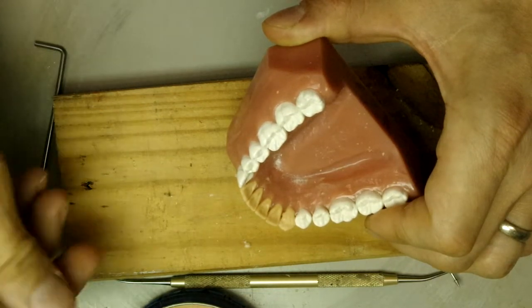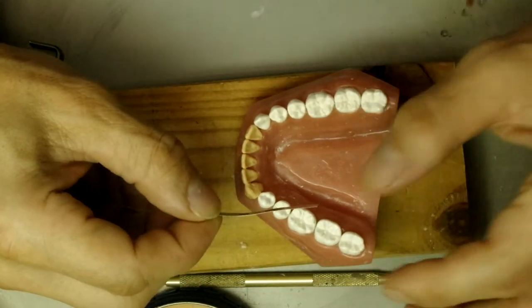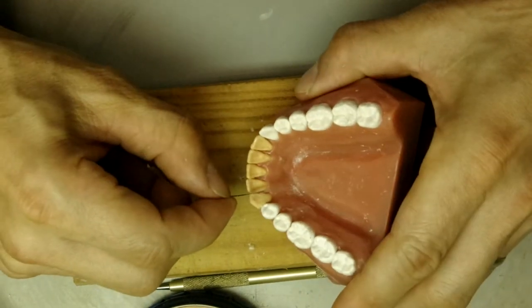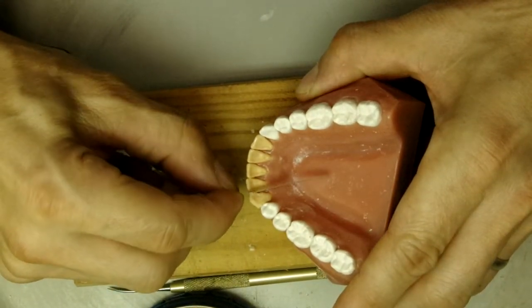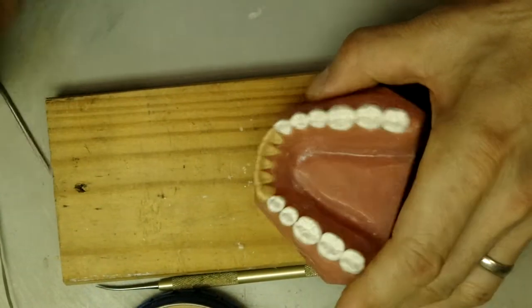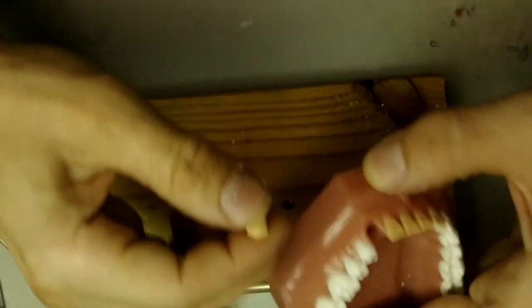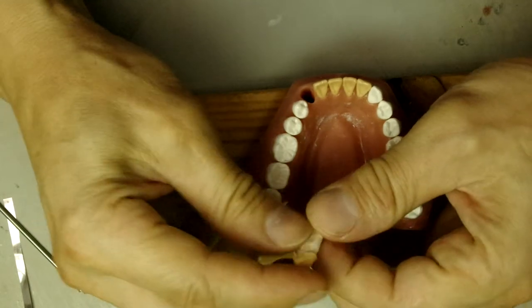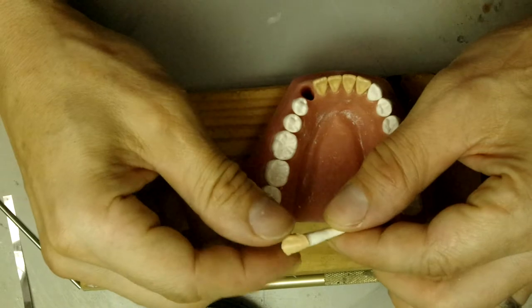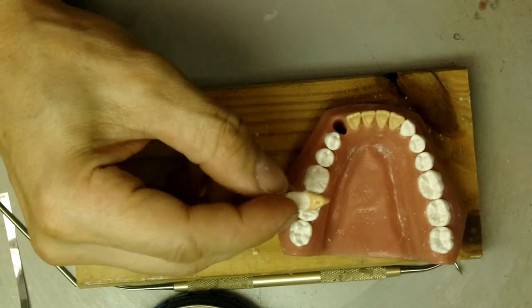Now we can take a little saw, and we're going to saw the interproximal so that we can remove the canine, just like that. I'm gonna pop that sucker out, and now guess what? Fix the margins. You must fix the margins before you continue.